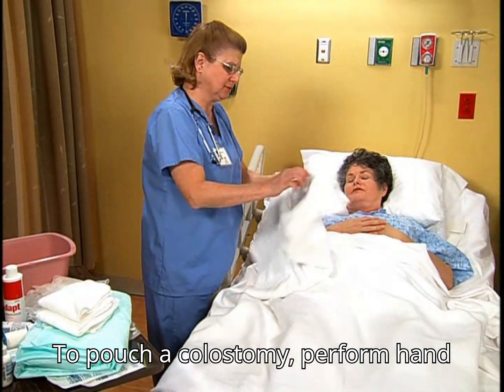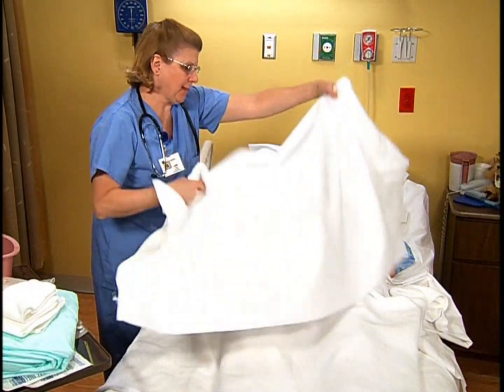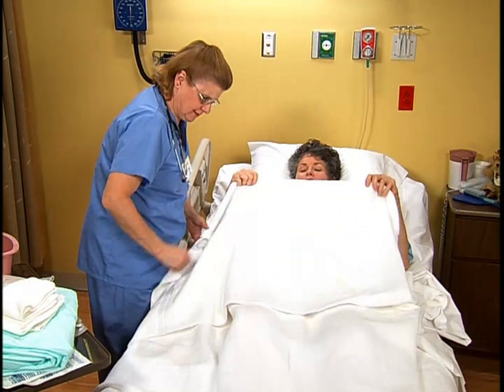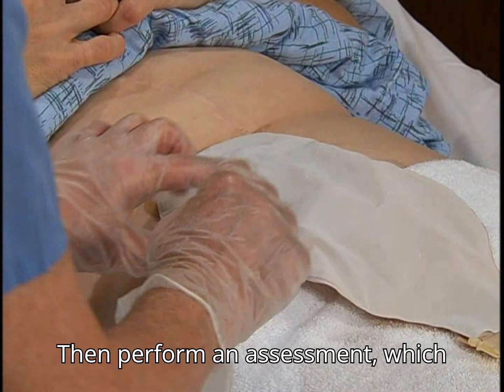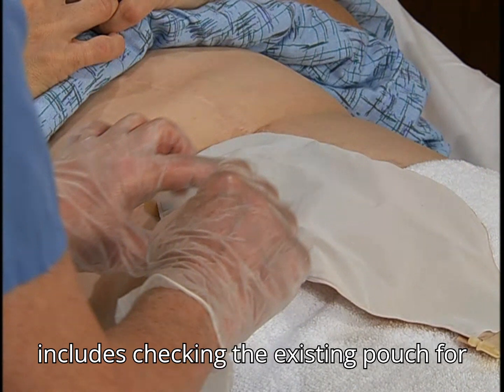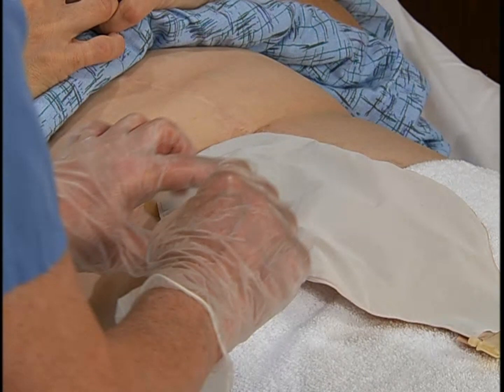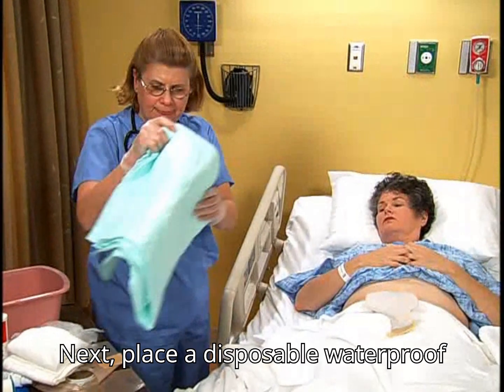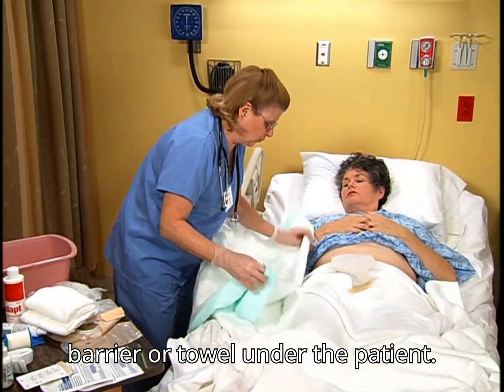To pouch a colostomy, perform hand hygiene and put on gloves. Then perform an assessment, which includes checking the existing pouch for leaks and assessing the surrounding skin for irritation. Next, place a disposable waterproof barrier or towel under the patient.